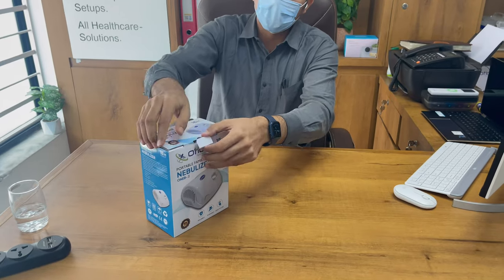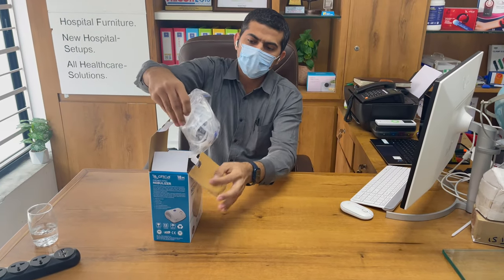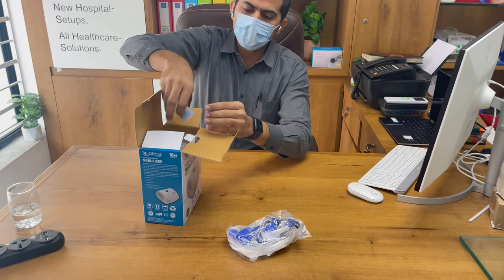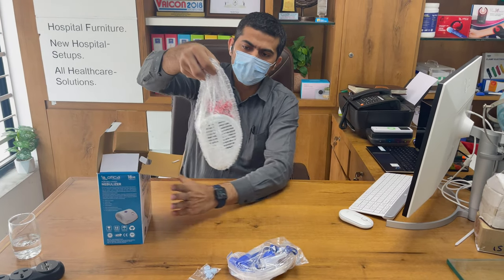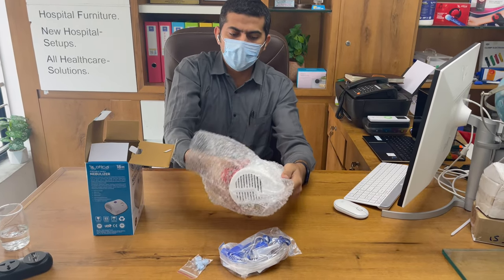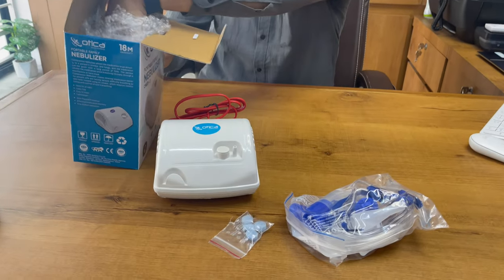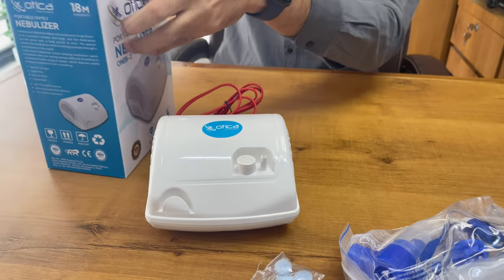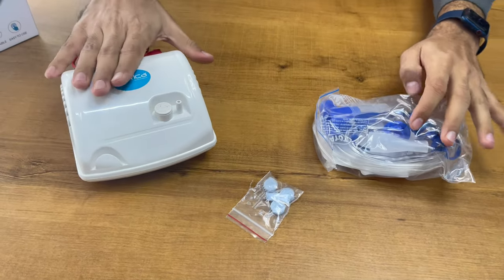We are going to start with an unboxing of the product. First of all, this is the mask set, this is the extra filter, and this is the main unit. It is quite a heavy and sturdy machine. You can see all the products that are coming in the box.